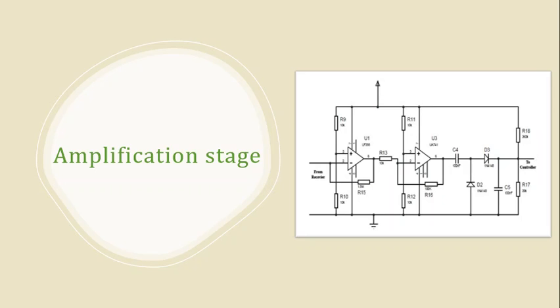Amplification stage. This stage is divided into two stages. The initial amplification phase's function is to amplify weak electrical signals to the point where they become strong enough to then enter the second amplification phase. This phase consists of a FET-type amplifier, whose properties are high sensitivity and low current at the input. The positive amplifier input voltage bias is secured by dividing half the value of the supply using resistors 9 and 10.